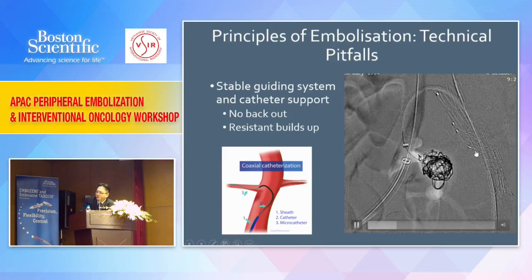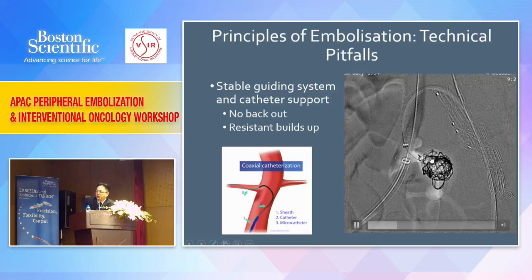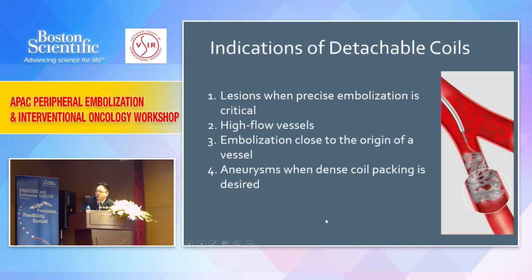And my colleague also with me, they say, just put a microcatheter in, start to deploy, then we do the job. I say, no, we really need to have a very stable and strong guiding system, otherwise we get stuck. As you go in, you see that as you come to the final bit, everything's falling back, and without a strong guiding system, it will back out. So a strong and stable guiding system is the key for successful intervention in most instances.